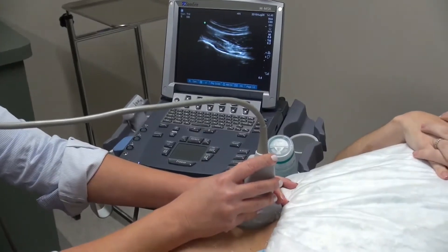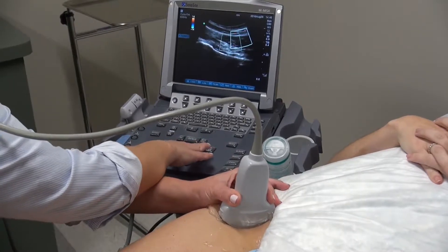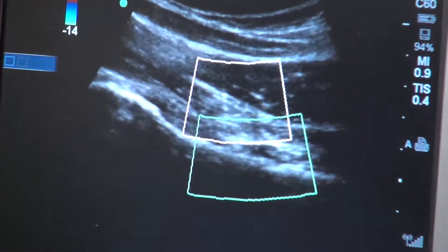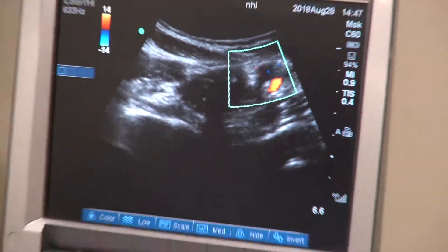During the survey scan, Doppler imaging can be used to locate small vessels to be avoided during the injection, as well as to visualize the femoral vessels medial to the joint. The femoral vessels are visualized in short axis, so the transducer is rotated.